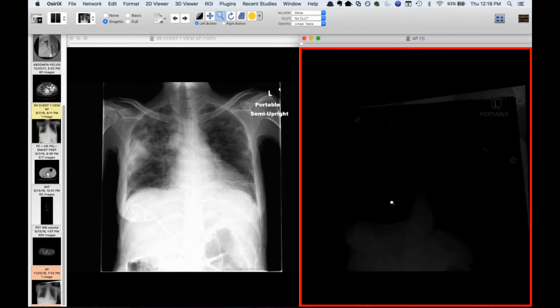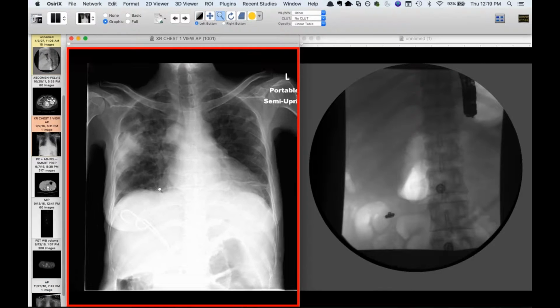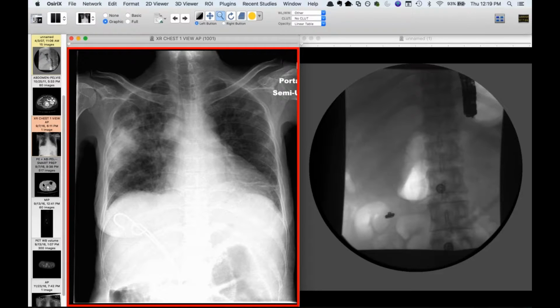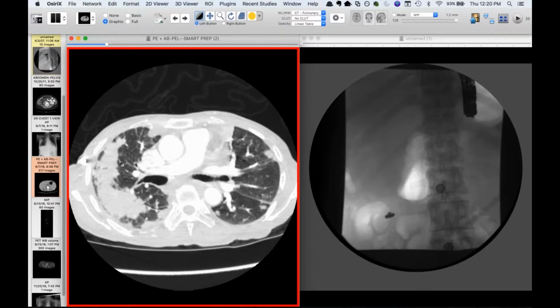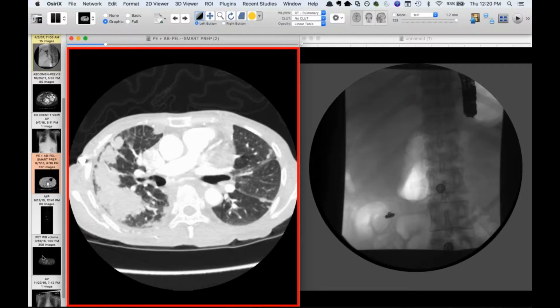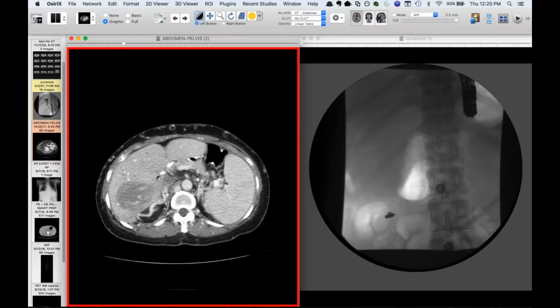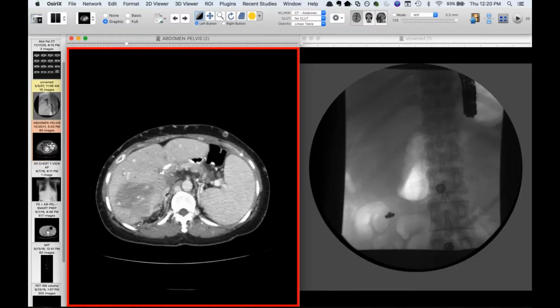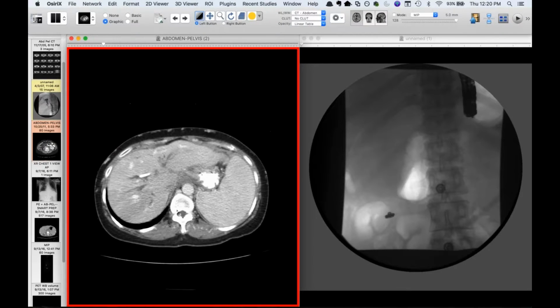Here she is 2 months later, and her lungs have substantially improved. So in between this, they re-looked at her original path from outside, and somebody put all this together and did some stains, and this is all IgG4 related disease. And we actually biopsied the lung a few days after this, and it was IgG4 related disease in her lung parenchyma too. So the original tumor wasn't a tumor at all, they think it was all just this big mass of IgG4 related systemic disease. And so probably she has some sort of biliary disease, PBC or whatever, that can be associated with the biliary strictures associated with IgG4 as well.